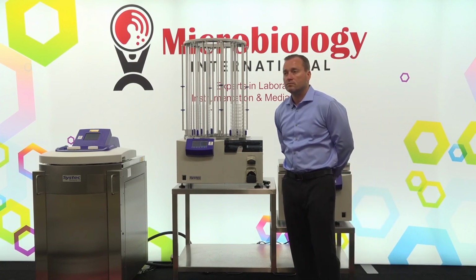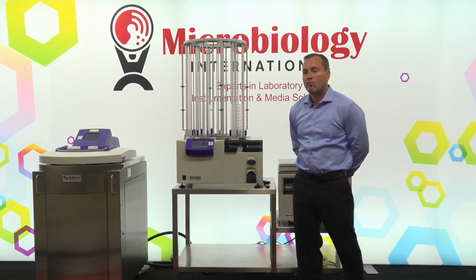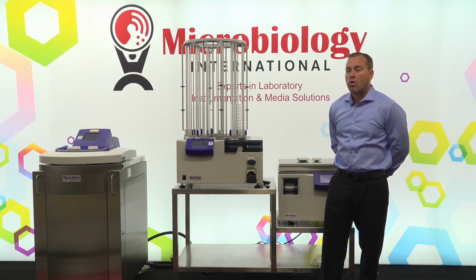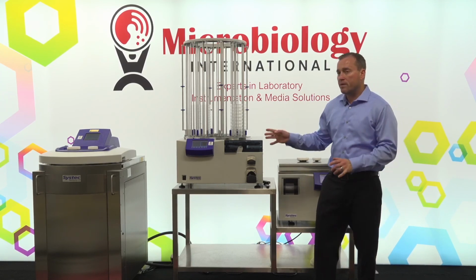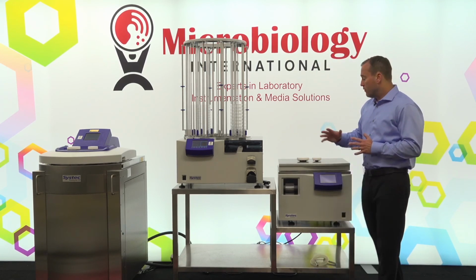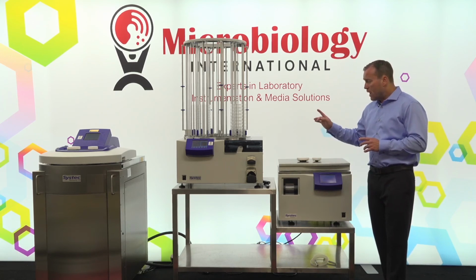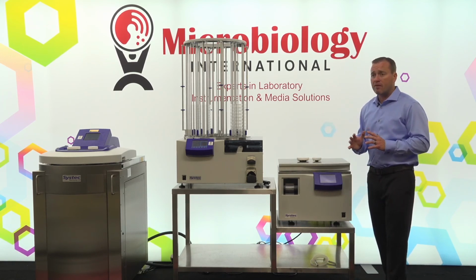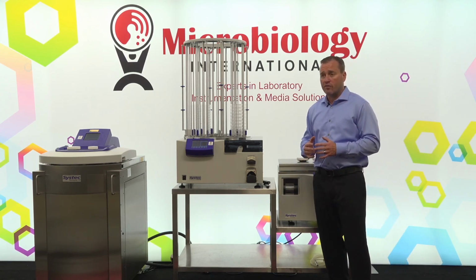Okay. And then on top of service-related items, do you offer any IQ/OQ services or calibration or temperature mapping and things like that? We do offer temperature mapping in all of our MediaPrep devices. We do offer IQ/OQ. They are a standard package for the MediaPreps as well as the MediaFill. And those would be able to be modified slightly to fit your application. We can also do performance qualification as well.